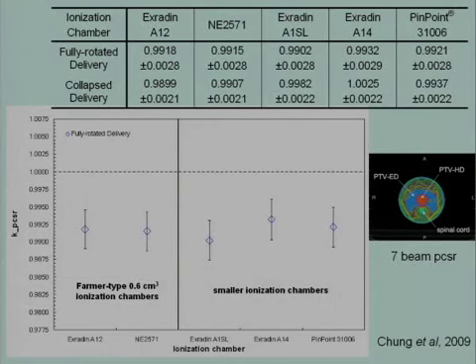Recently, we've done some measurements on PCSR corrections. What you expect, of course, is that this PCSR correction should be small, because you're trying to realize perfect charged particle equilibrium conditions. And so the challenge will be to describe the criteria for the establishment of such PCSR for different clinical conditions. But the bottom line is that your protocol will be approximately the same. You will just have an additional factor that will be measured in a field, the conditions for which will be described in the protocol.